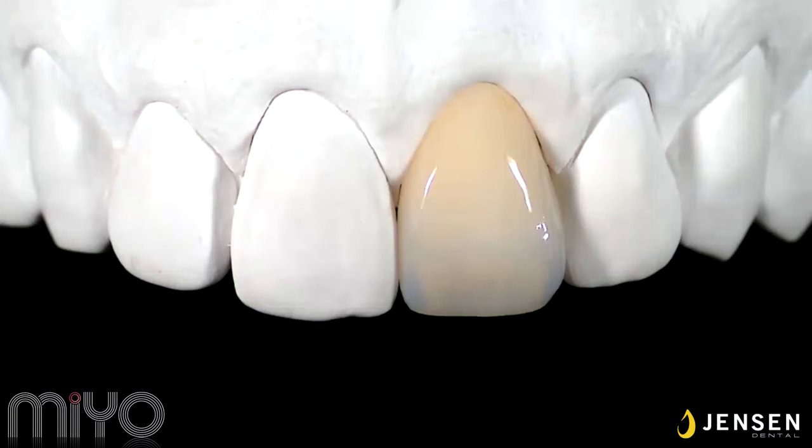Here is halo spring to create my halo effect. The material itself will not mix unless you intentionally do so. Halo usually wraps around the corners near the interproximal region. So dab and float your color around the corners.